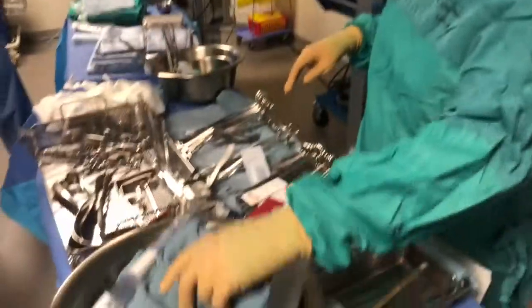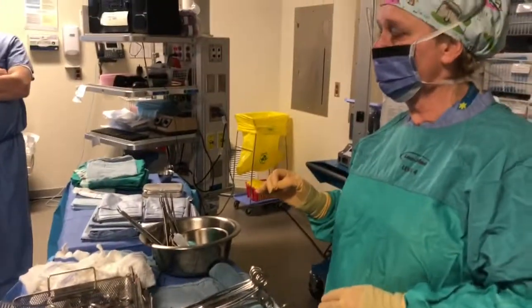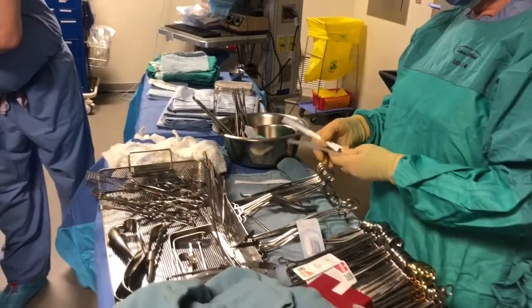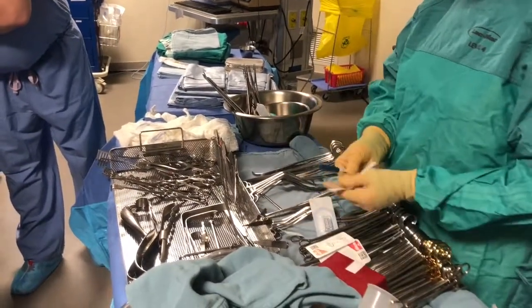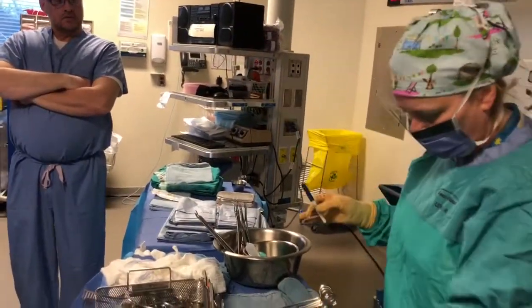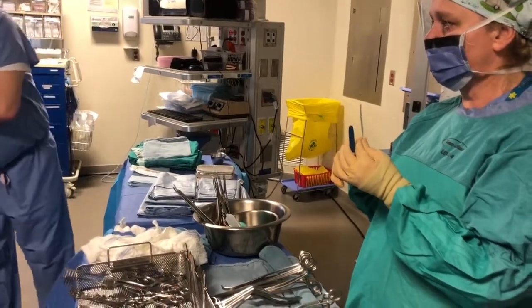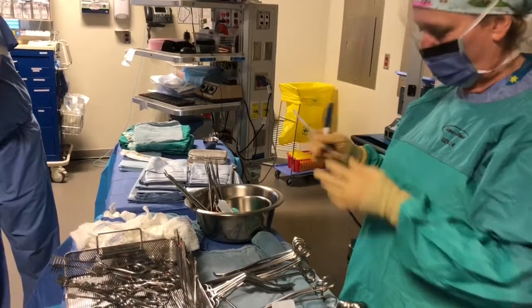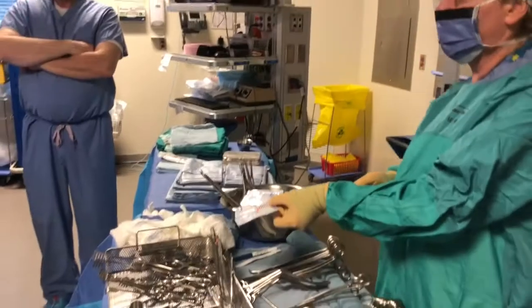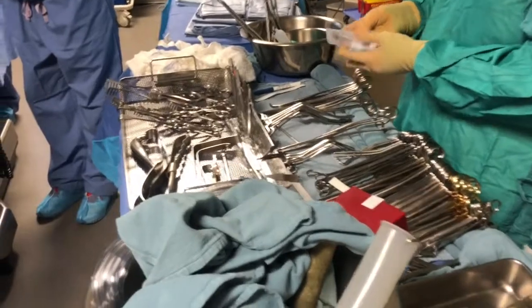And then we would have a Bovie tip because they're definitely going to use cautery. So you would put 1 for Bovie tip. That's next on the list. Then we have a pen, a cap, and a ruler. There are 2 pieces to our pen, and 1 ruler. So you would put 2 for the pen pieces and 1 ruler. And then we have 1 extra thing on our set, and it's 3 hemoclips. So you look for that, and you put 3.